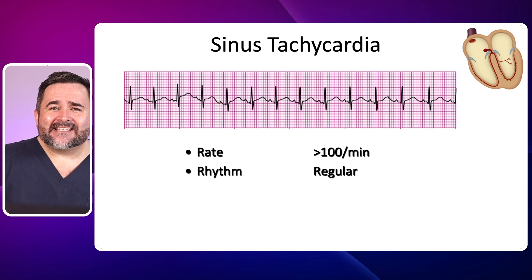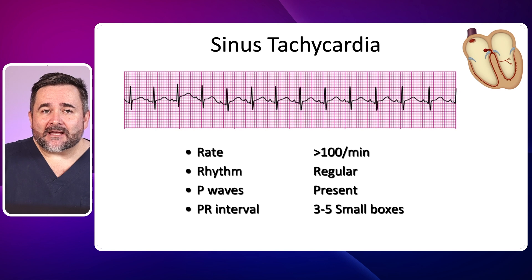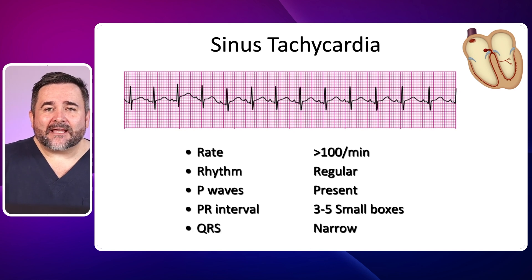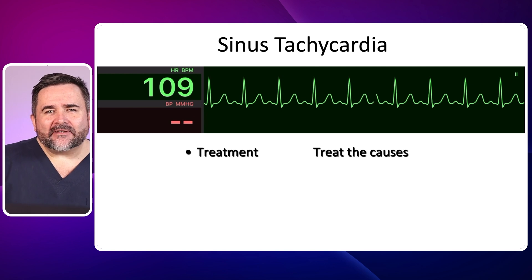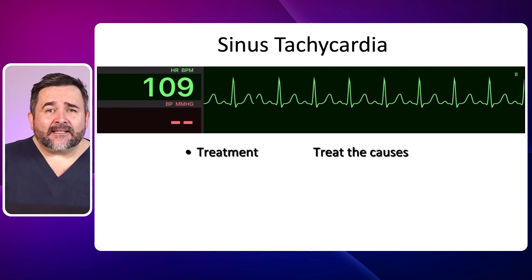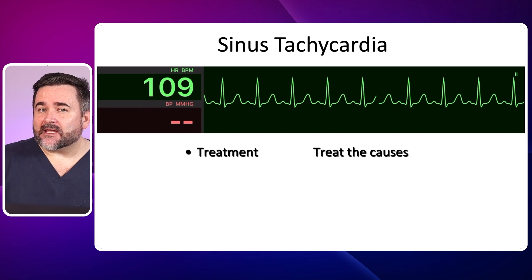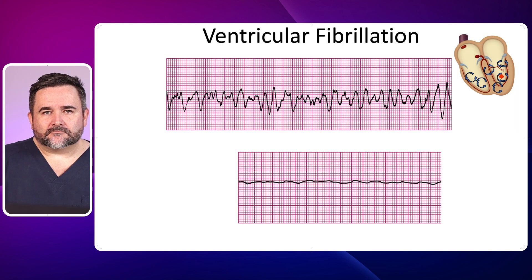Sinus tachycardia looks exactly like a normal sinus rhythm but this time the rate is above 100 beats per minute. The rhythm is regular, P waves are present, the PR interval is 3 to 5 small boxes, and the QRS complex is narrow. Here we have sinus tachycardia at a rate of 109 beats per minute. Sinus tachycardia can be caused by exertion, anxiety, hypovolemia, and hypoxia, to mention a few. Treat the causes of the tachycardia.